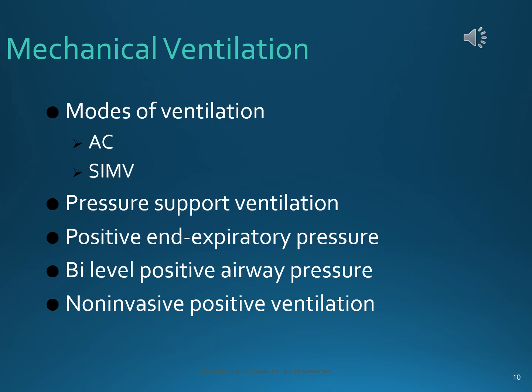Mechanical ventilation is something that you will see quite a little bit of when you're at Kindred. I won't go through this a lot. You have an entire clinical prep on this when you go to respiratory. There are a number of different modes of ventilation depending on what the patient needs. So assist control, or continuous mechanical ventilation, delivers a breath each time the patient begins to inspire.